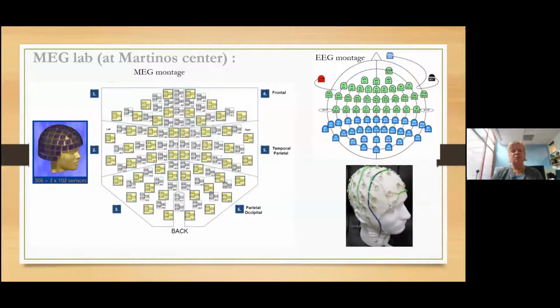And it's also not just a visualizing tool, as Noam mentioned. It's an analyzing tool as well. And that's why we're working together, first of all, to generate pipelines for the most difficult cases and to bring the MMVT results together with xfit. And xfit, we know, is FDA approved, and therefore we're checking each other on how accurate our results are. And here's an example of our montage from our lab.